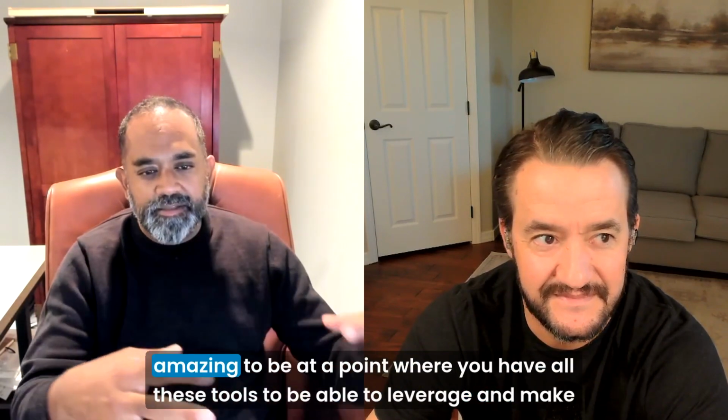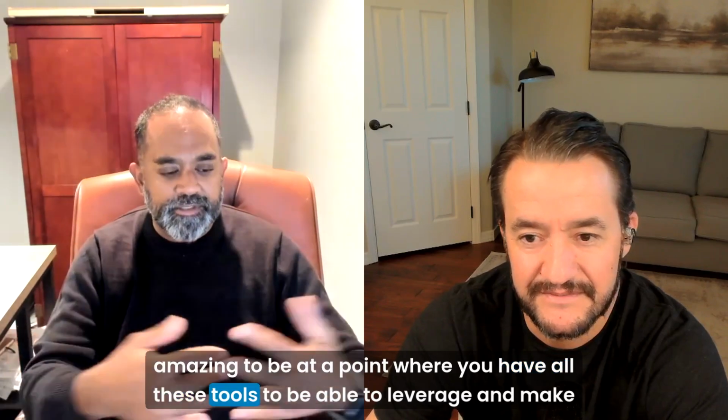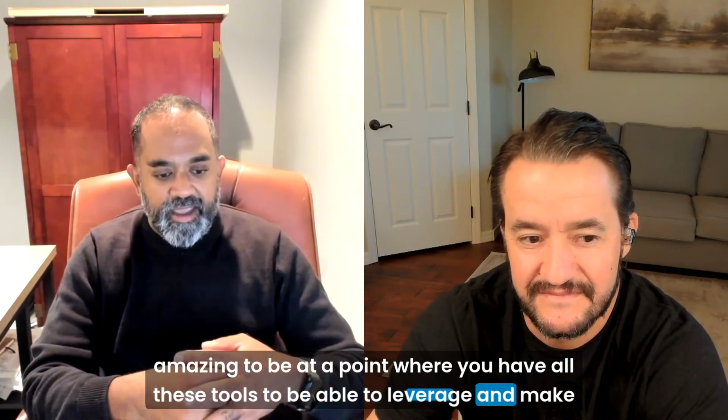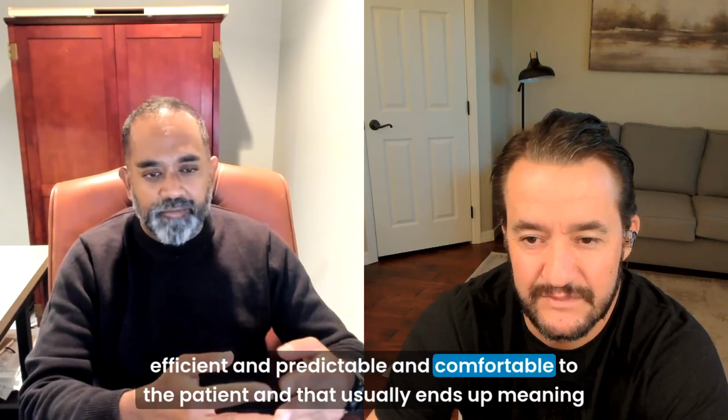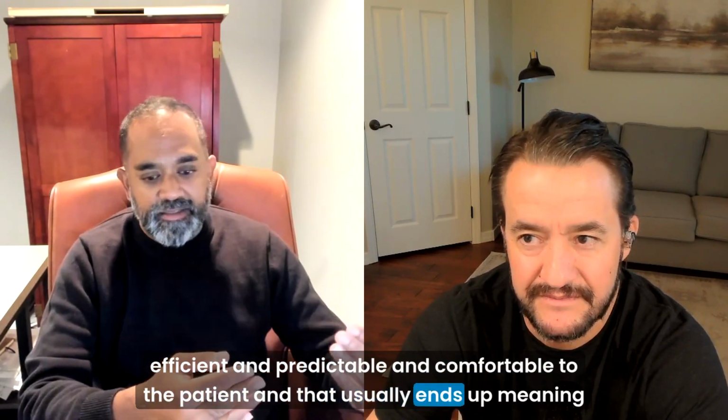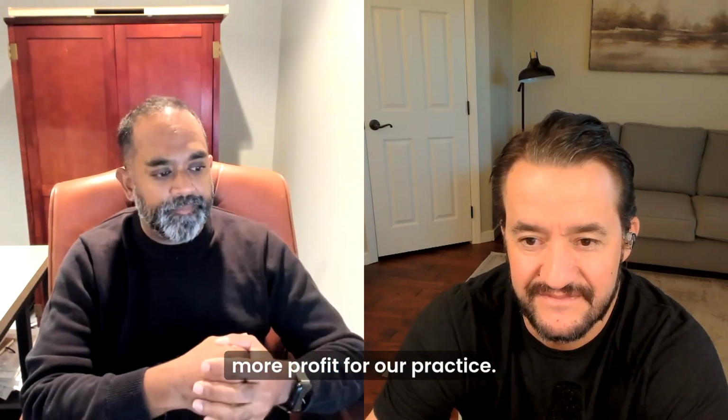It's really amazing to be at a point where you have all these tools to make treatment so efficient, predictable and comfortable for the patient, and that usually ends up meaning more profit for our practice.